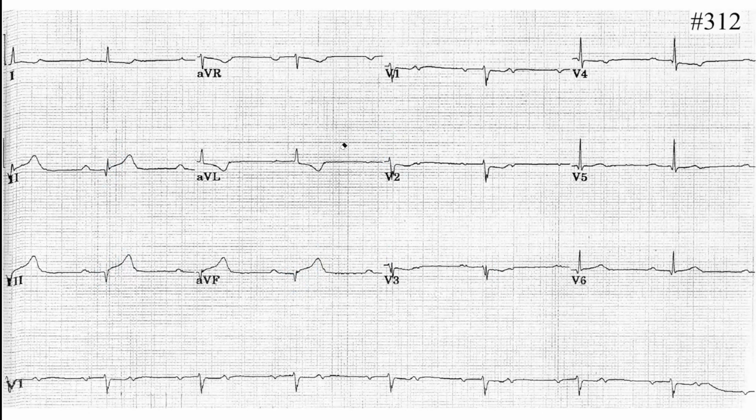At maximum, they will say, okay, that's too much. No, it's not too big a problem. It's not pathological. They won't count it as an error. Believe me.